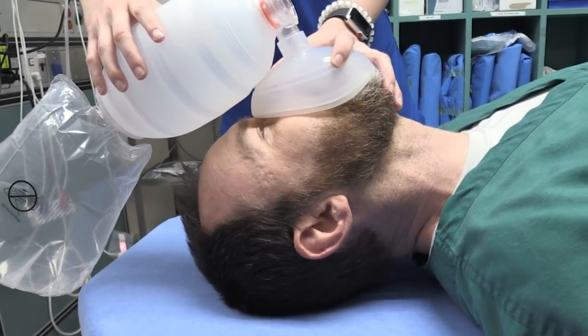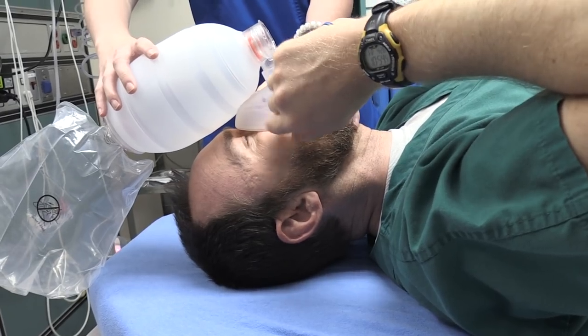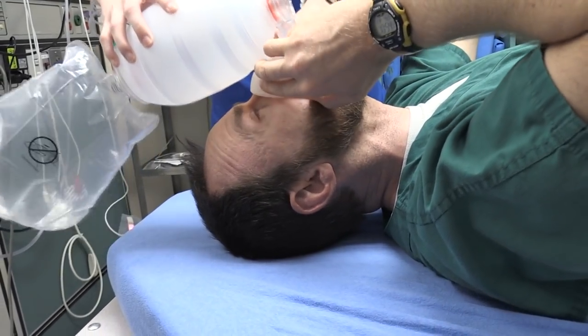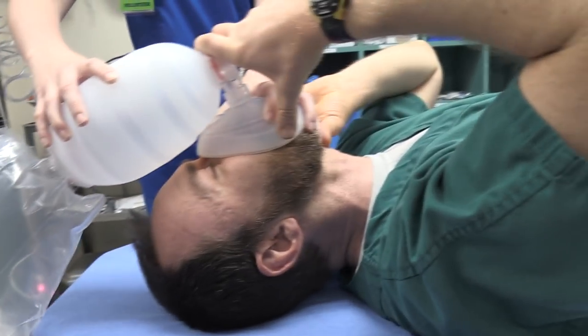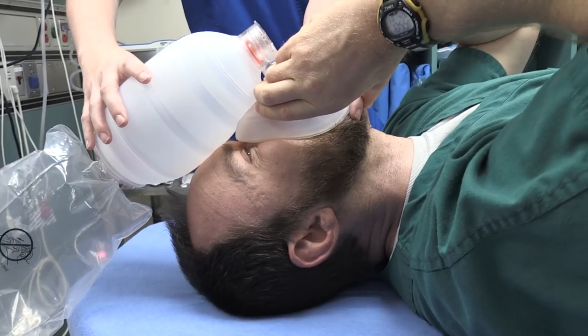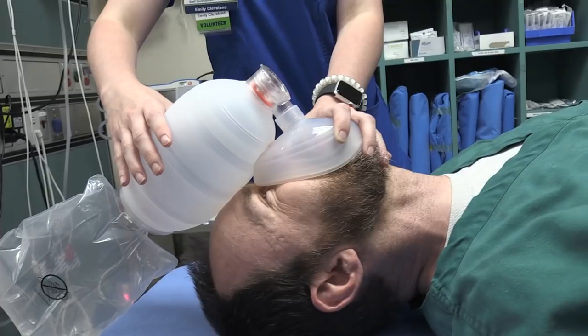So how's that feel, Tim? I do feel slightly near my right arm. Let's see. It's okay, Emily, you can push hard if you want. Because it's a fairly soft, nice, cushy mask. It's very cushioned. Yeah, it's going in.